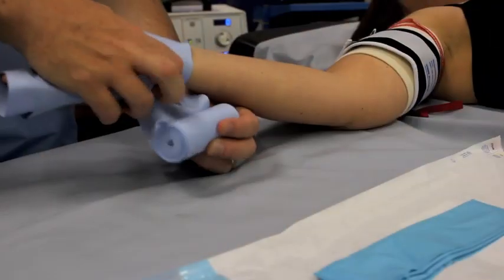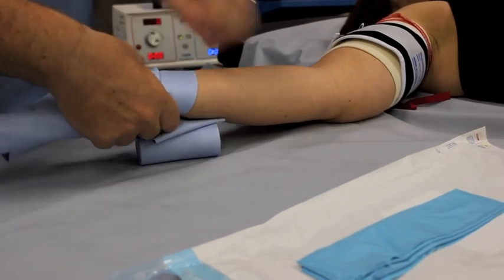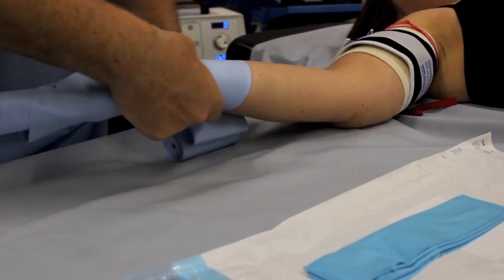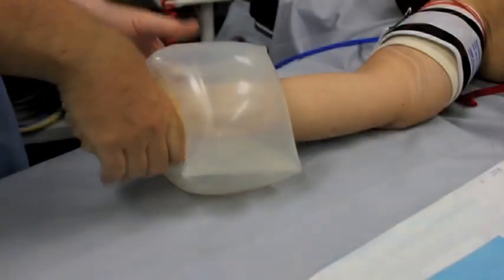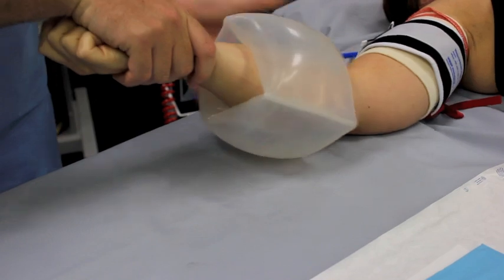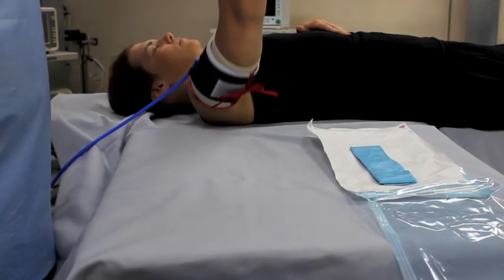There are various techniques of exsanguination, including the use of an esmarch bandage. The VBM range includes a sterile, disposable version available in various widths. VBM also offer an alternative in the form of roll-on cuffs. Exsanguination can also be achieved using elevation.